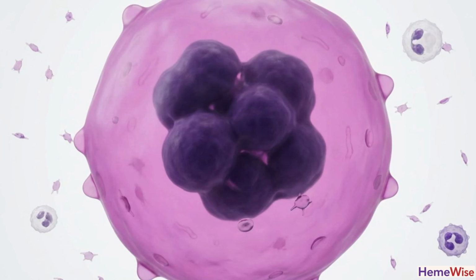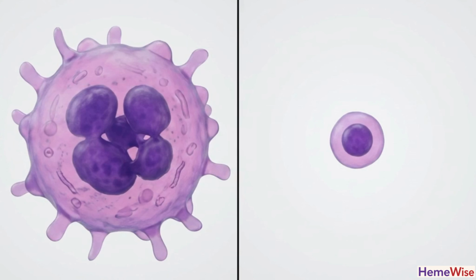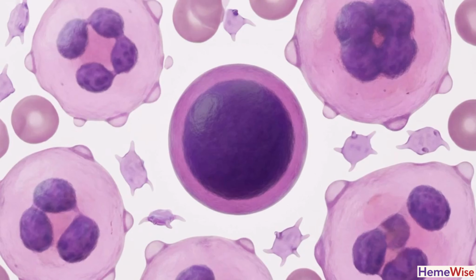The aspirate is also used to assess megakaryocytes. These large polyploid cells normally feature multiple nuclear lobes and are found near the vascular sinusoids. We contrast normal forms against the dysplastic micromegakaryocytes found in myelodysplastic syndromes. These small, abnormally lobated cells are hallmark evidence of a clonal disorder.